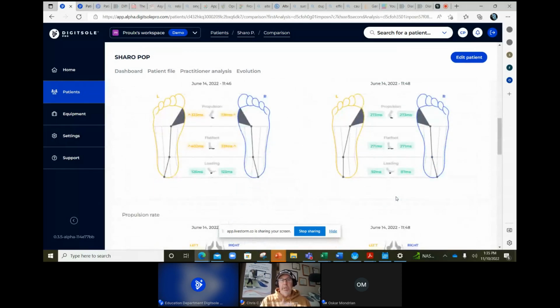And when we look at her gait line here, we see that the trajectory is almost the same, right? It's a little bit different on this side, but that's not that unusual that she has a slight deviation, especially when you don't have them go for extended periods of time. So she still seems to be a little bit on the inside, on the medial aspect.